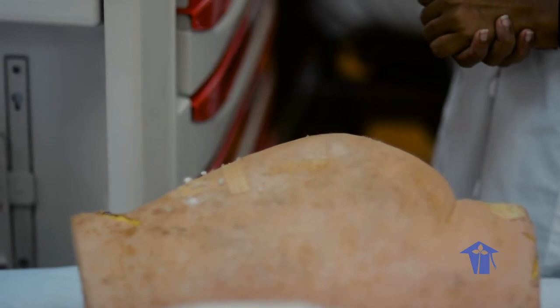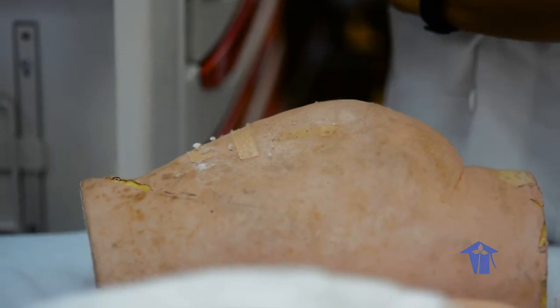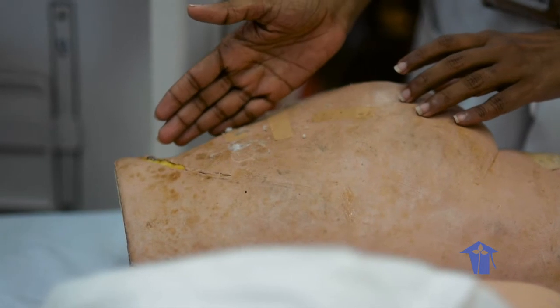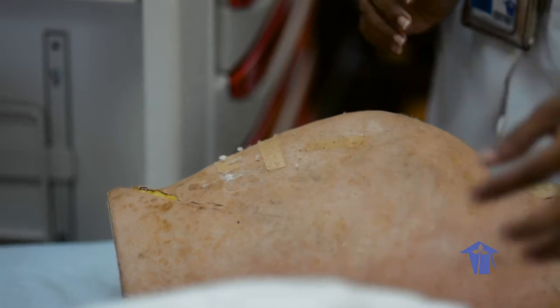Discuss the various sites for administration of intramuscular injection. There are 3 sites. There is the deltoid, there is the thigh, and there is the upper outer quadrant of the gluteus. Select an appropriate administration site. So we are going to use the upper outer quadrant of the gluteus.